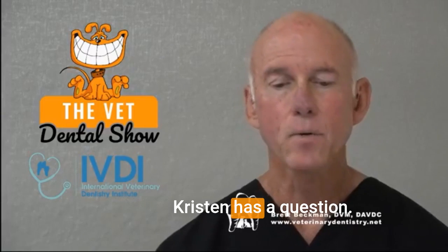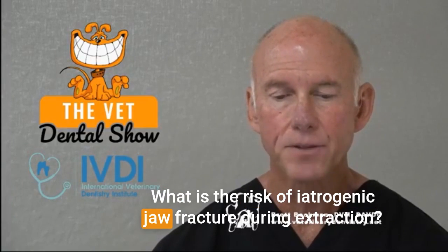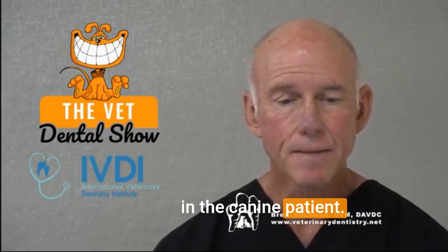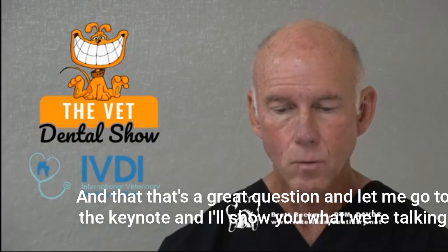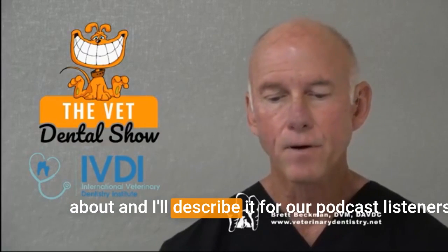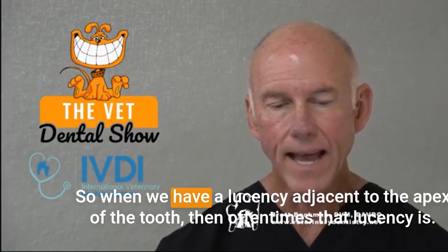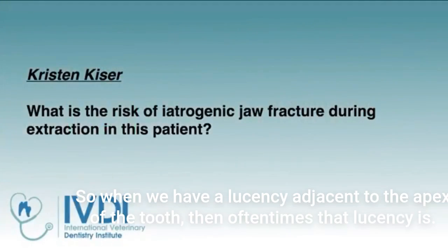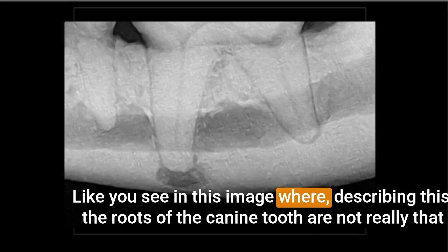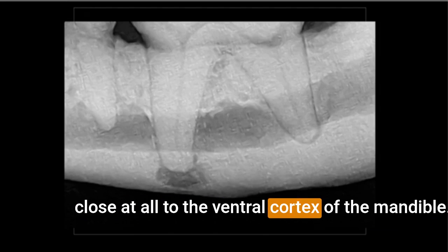Kristen has a question: what is the risk of iatrogenic jaw fracture during extraction in the canine patient? Let me go to the keynote and I'll show you what we're talking about. When we have a lucency adjacent to the apex of the tooth, oftentimes that lucency is like you see in this image — the roots of the canine tooth are not really that close at all to the ventral cortex of the mandible.